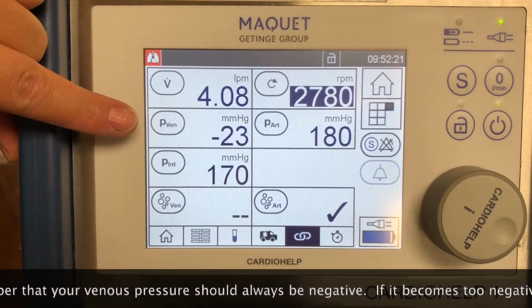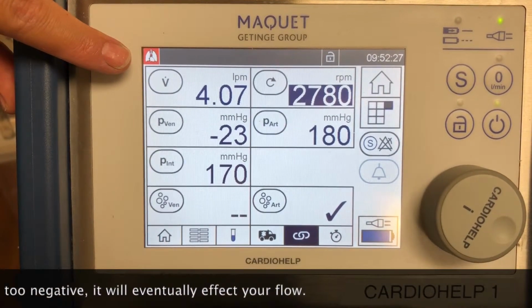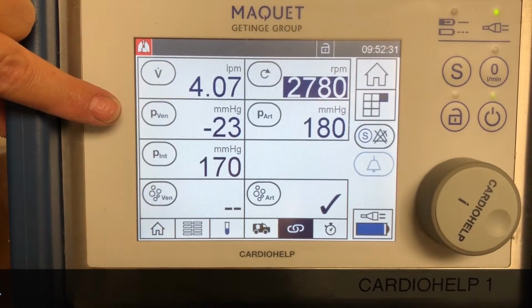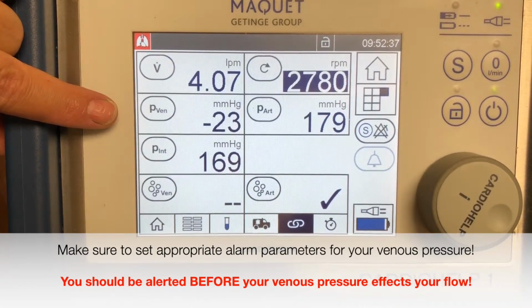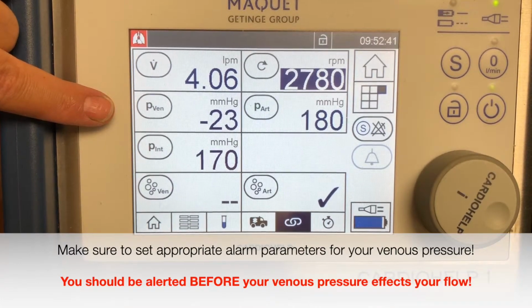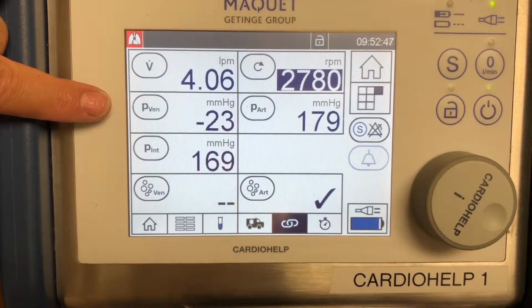If you have set your negative pressure parameters, your low priority and high priority, you should be notified before it actually affects your flows. If it does not give you an alarm and your flows are affected, that means the ranges you've set for your negative pressure are too far off or too negative. But if they go off too early, but you still have the same flows, maybe you have set your negative pressure parameters a little too tight.